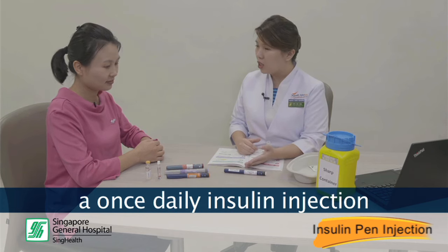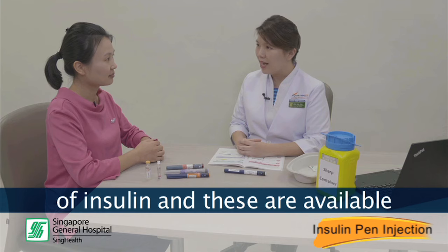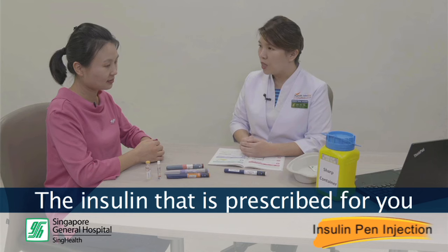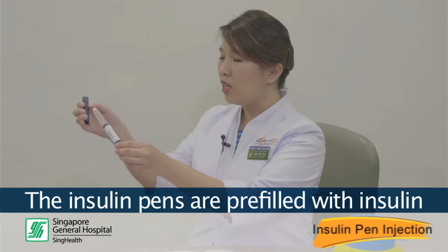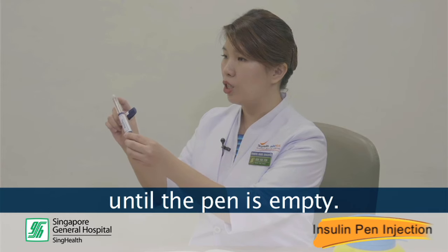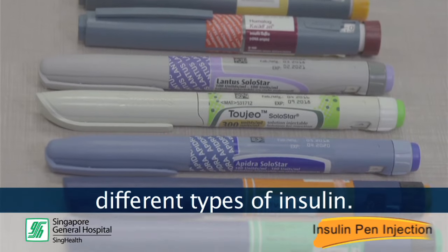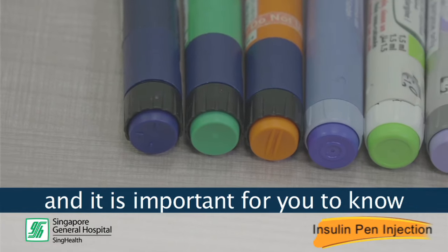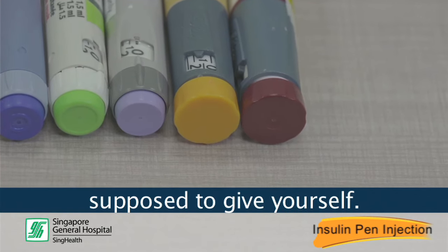There are many different types of insulin and these are available in vials, cartridges, and insulin pens. The insulin that is prescribed for you is a basal insulin that comes in an insulin pen device. The insulin pens are pre-filled with insulin and you can use it multiple times until the pen is empty. There are many different types of insulin pen devices, each containing different types of insulin. These are coated with different colours, and it is important for you to know the name of the insulin you are on, recognize the pen device, and how much insulin you are supposed to give yourself.